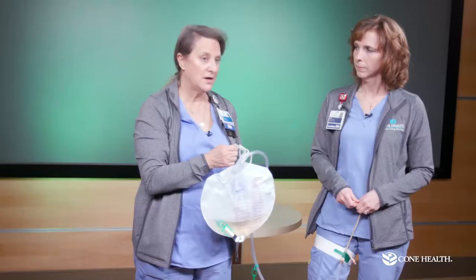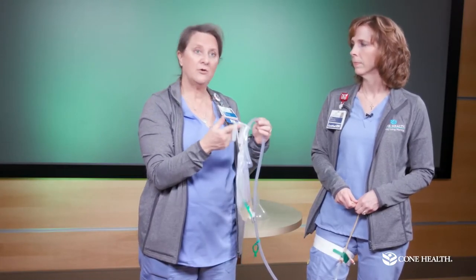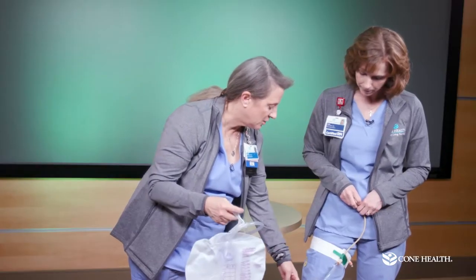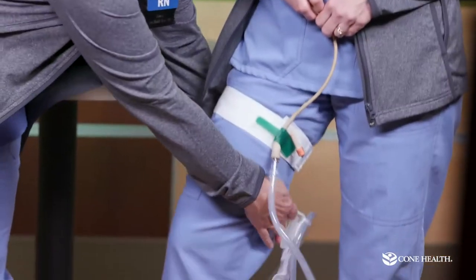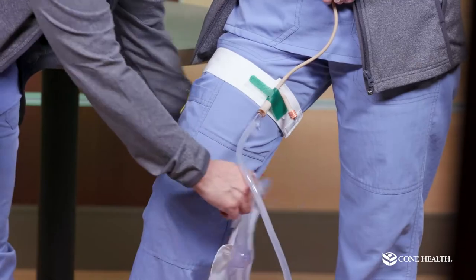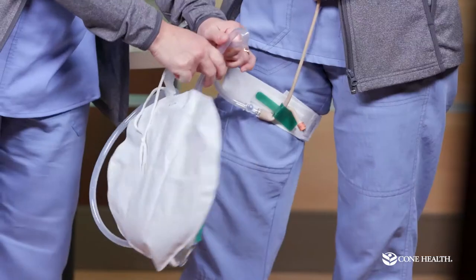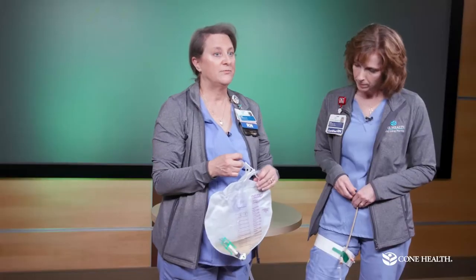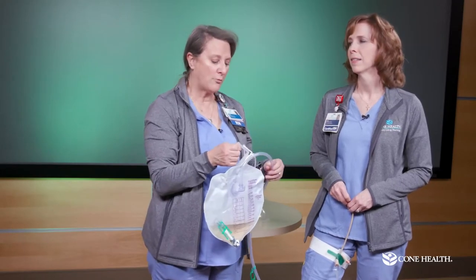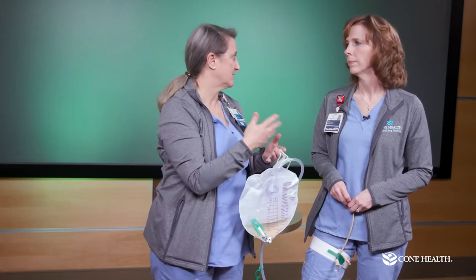The big bag has a handle on it so you can hang it on a chair rail or bed rail. Catheter tubing always needs to rest on top of the leg — not underneath, as that might cut off the flow of urine. If your catheter is not draining, always check to make sure it's not kinked. If you have pets that like to chew, consider putting them out of the bedroom at night, or covering the tubing with a pillowcase so it's out of sight, out of mind.